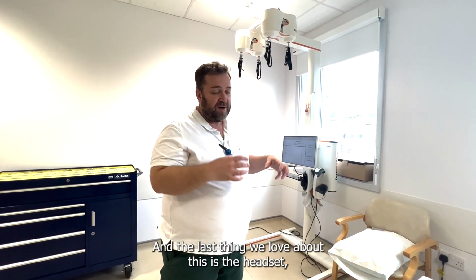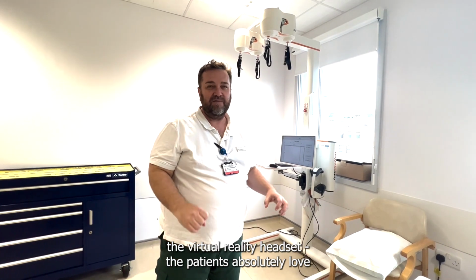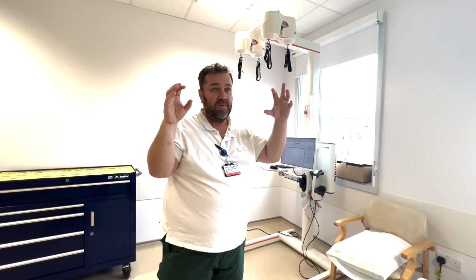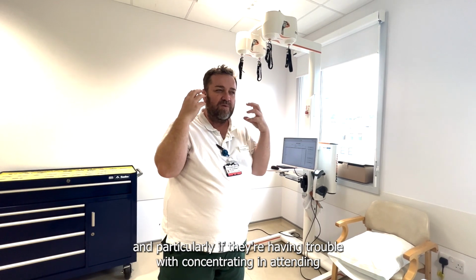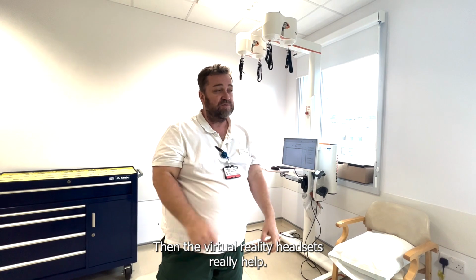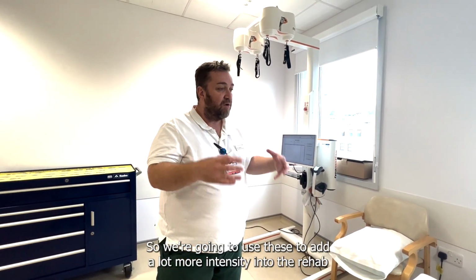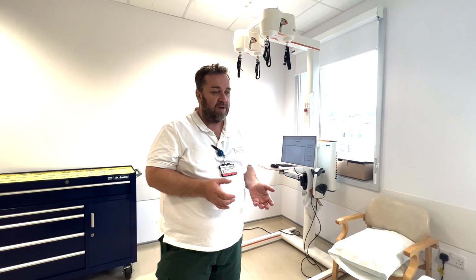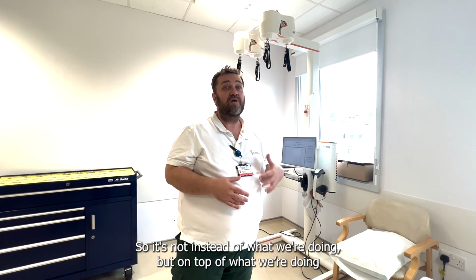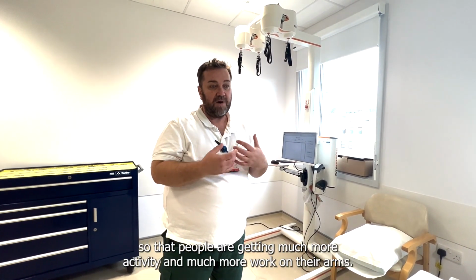And the last thing we love about this is the headset. The virtual reality headset patients absolutely love because it enables them to reach up and really get immersed in the game, and particularly if they're having trouble with concentrating and attending to what's going on, then the virtual reality headsets really help. So we're going to use these to add a lot more intensity into the rehab that our people are getting, so it's not instead of what we're doing, but on top of what we're doing, so that people are getting much more activity and much more work on their arm.